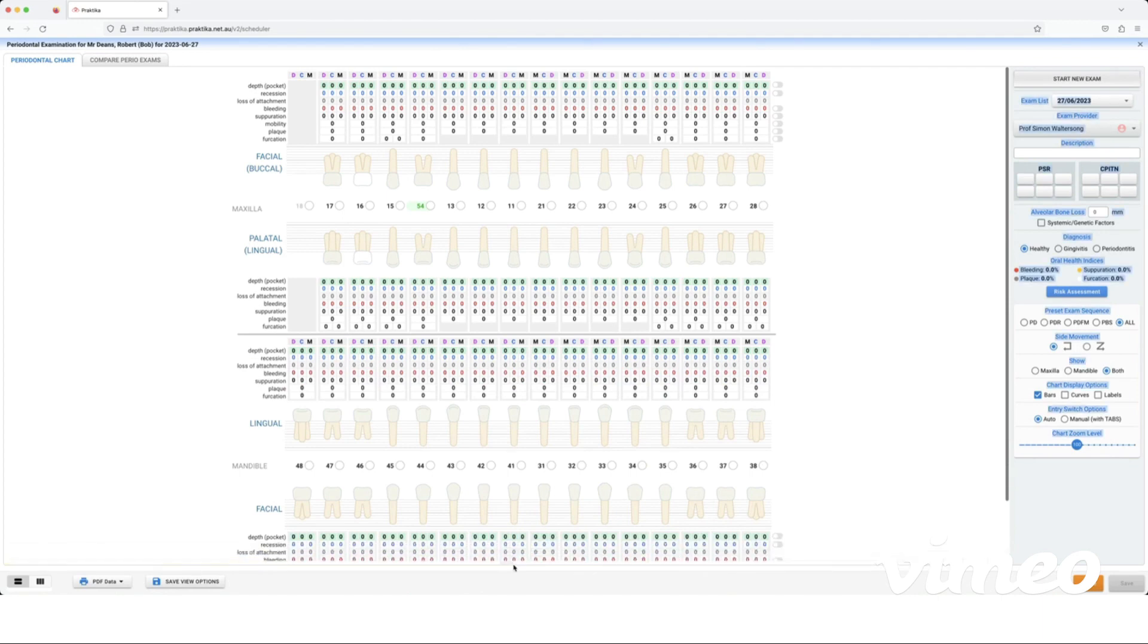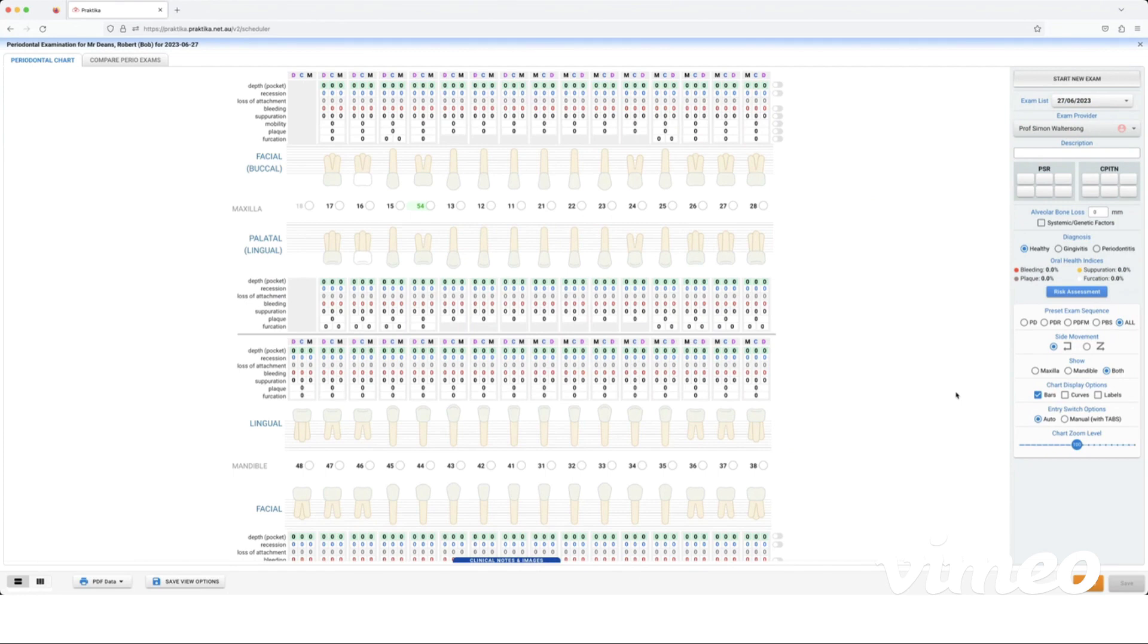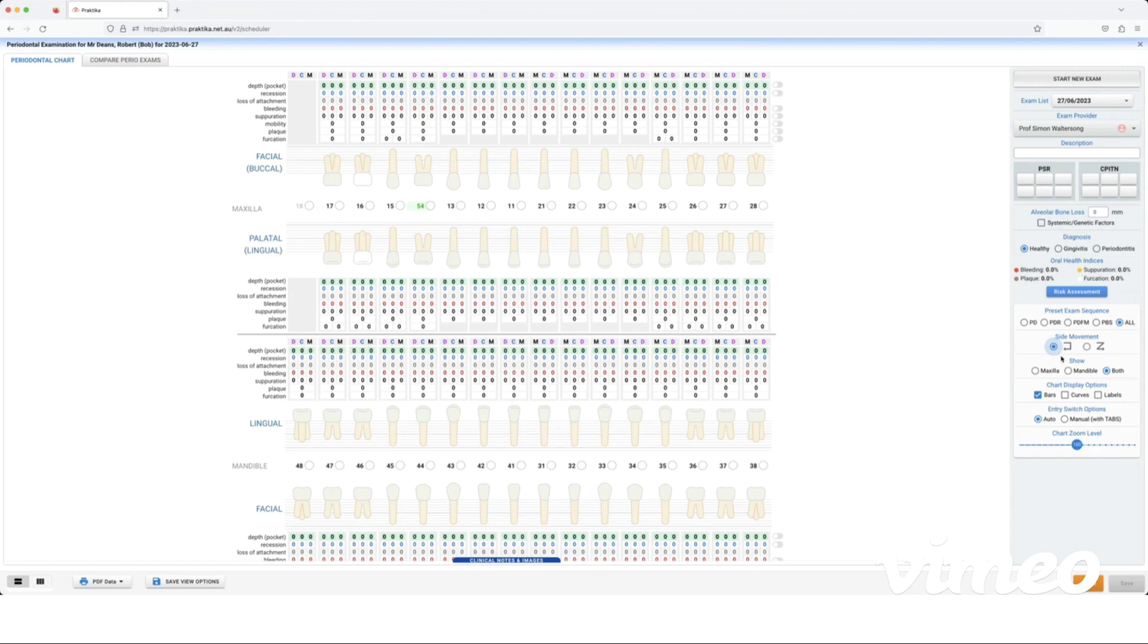Now on the right hand side we have the option to change the way the chart moves. Most of the time it's in this movement, so that's the default setting. We can show just either the maxilla or the mandible, or we can show both. As a default it will be set on both.